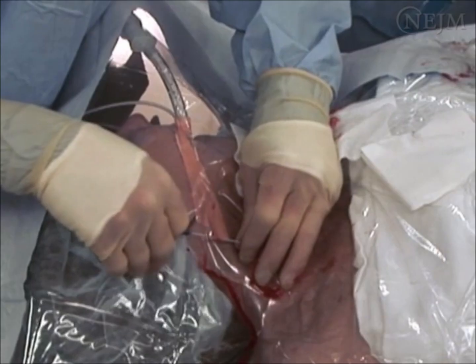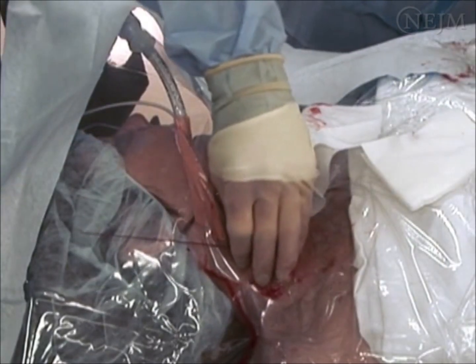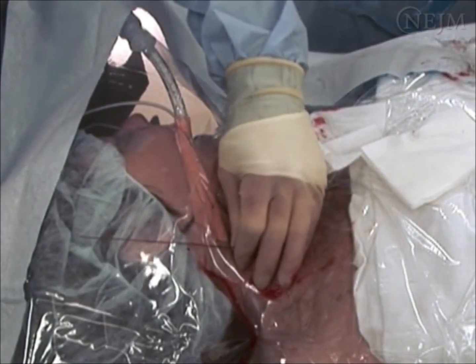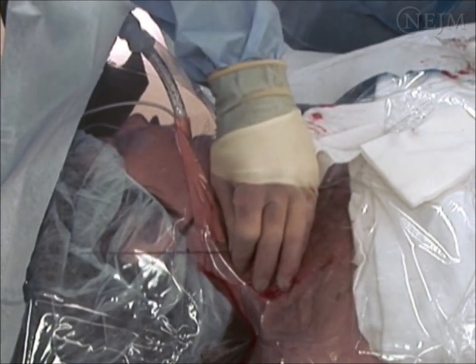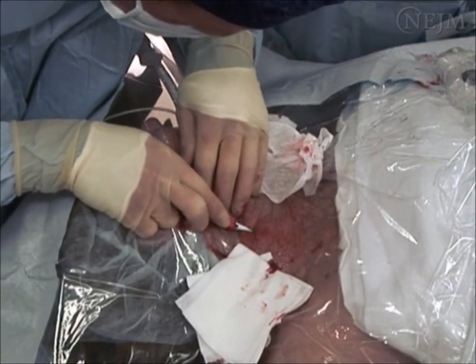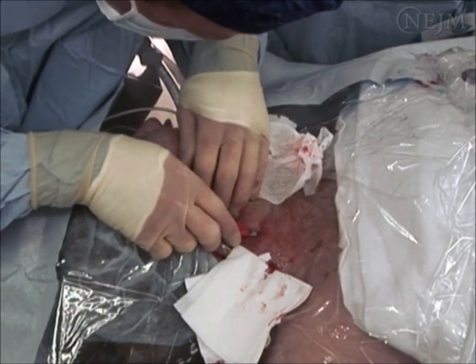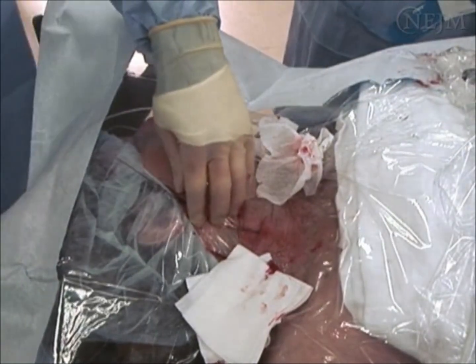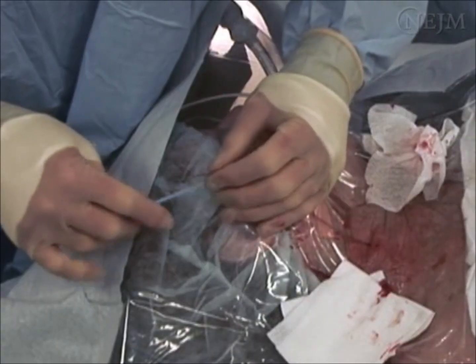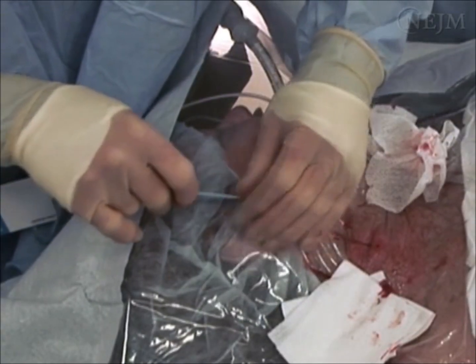After the guide wire has been inserted, withdraw the needle, leaving the guide wire in place. As the needle exits the skin, be sure to grasp the guide wire at the skin. At this point, only the wire remains in place. Using an 11-blade scalpel, make a small superficial incision at the entry point of the wire to facilitate passage of the dilator through the skin. Be careful not to cut the wire.